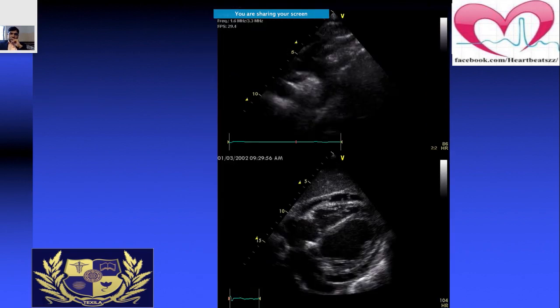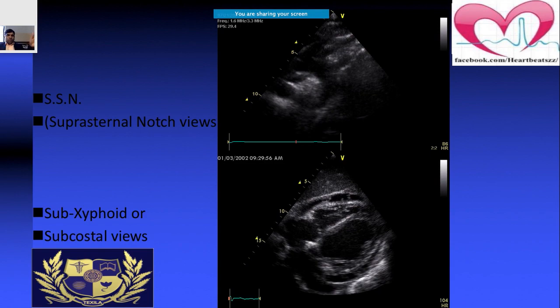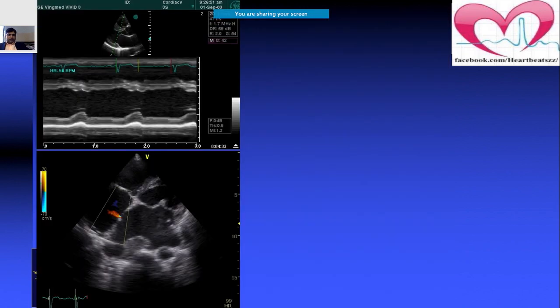This is the suprasternal notch view. The image below shows a patient with pericardial effusion in the subcostal (subxiphoid) view. A key technique for this view: ask the patient to fold their legs, take a deep inspiration, and hold it — this allows you to better visualize the cardiac structures and inferior vena cava.